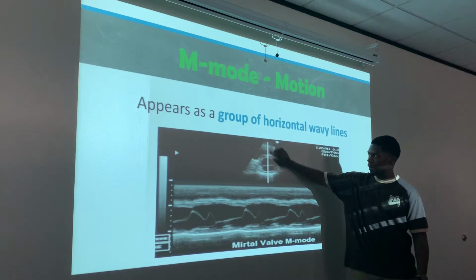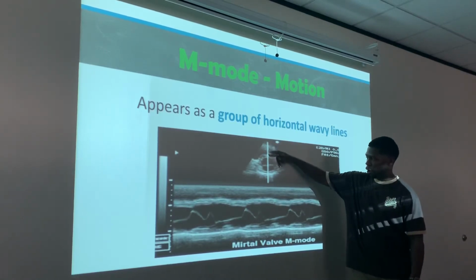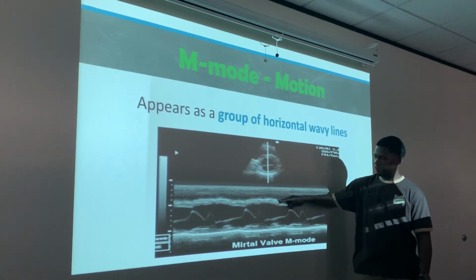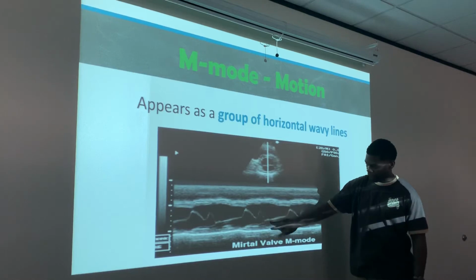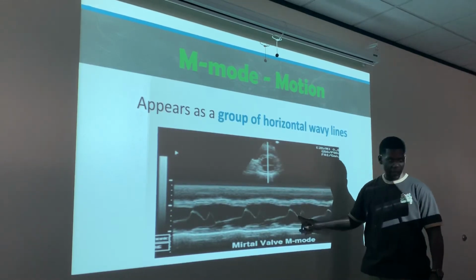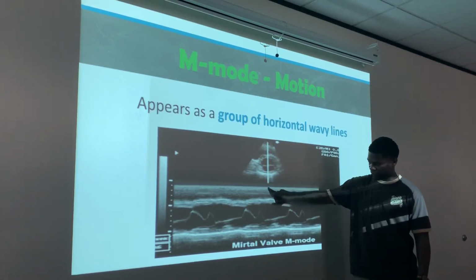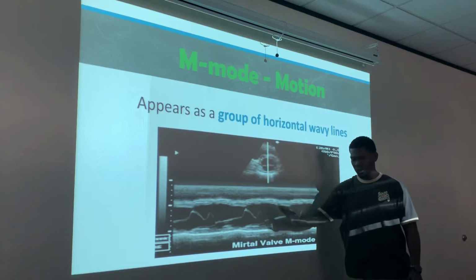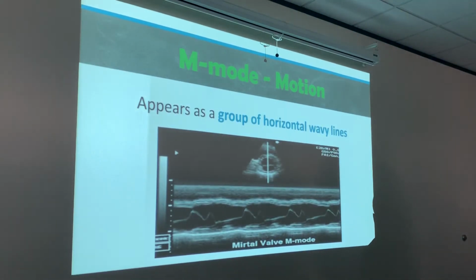As it gets deeper, you have tissues and fat. Then when it hits the heart wall, which is right there, you see that line. This line is going to travel through the heart all the way through. All this represents the heart. These represent moving valves within that heart. And posterior to that, we have just the rest of that sample volume. So this one line is representing just that one slice of anatomy, not the whole image. That's mitral valve, right? Absolutely, that's a mitral valve.